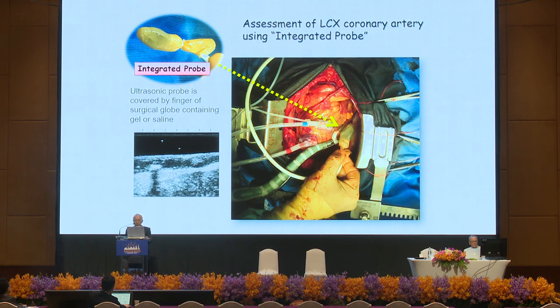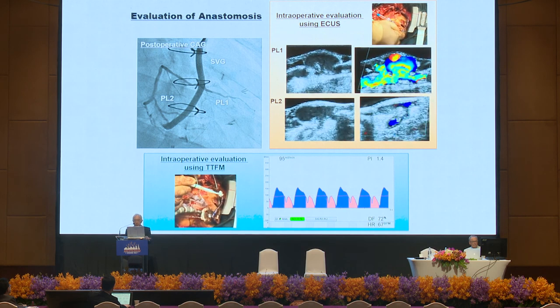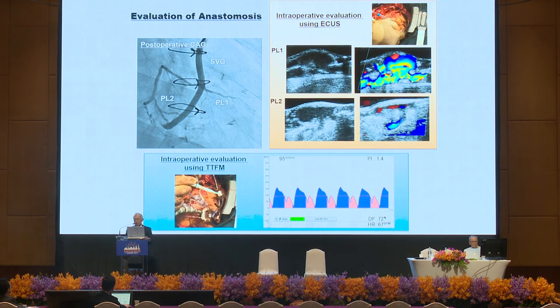So this is a typical case of the evaluation of the anastomosis, a sequential graft for the PL1 and PL2.